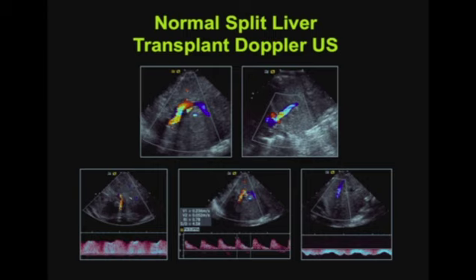And also, I would just want to emphasize that it's so important to speak with the surgeon, or at least to have a diagram of what the surgical anatomy was at the time of surgery, because that will save you a lot of grief later on and will help you in terms of knowing what anastomoses you are trying to evaluate.